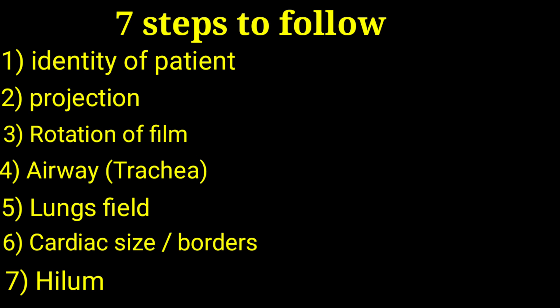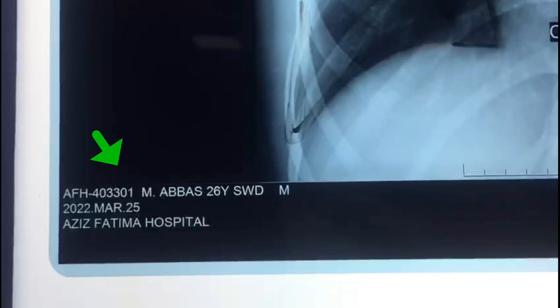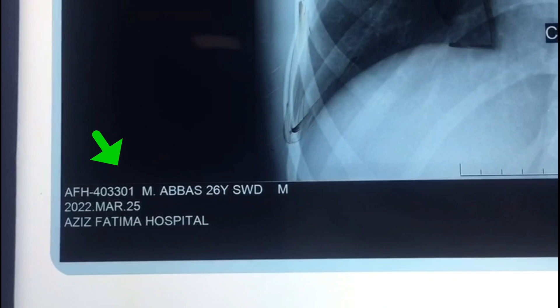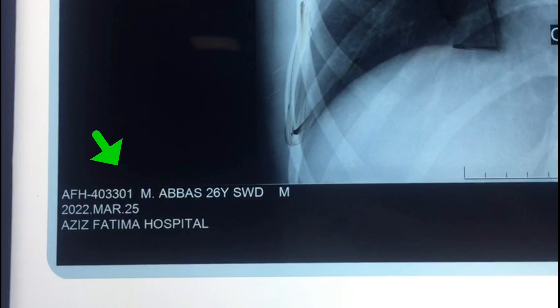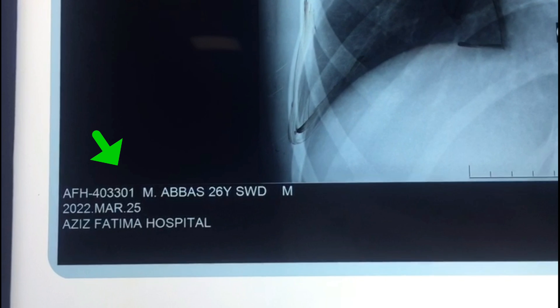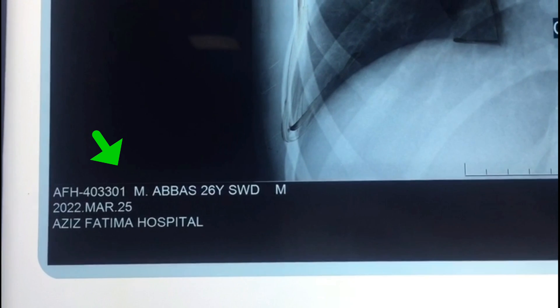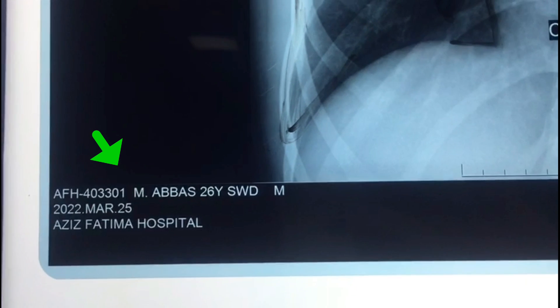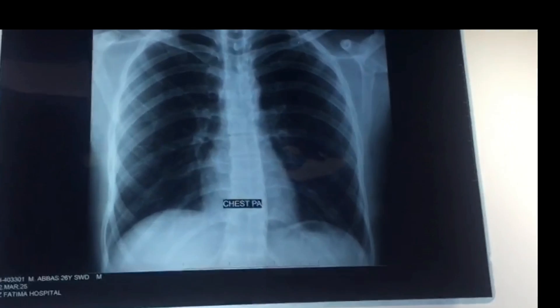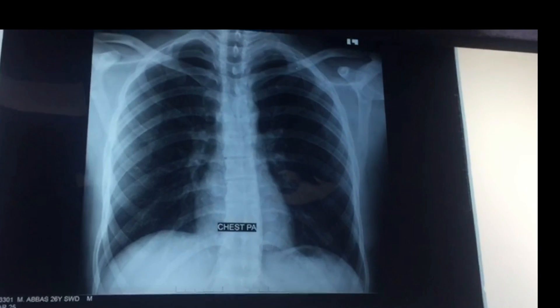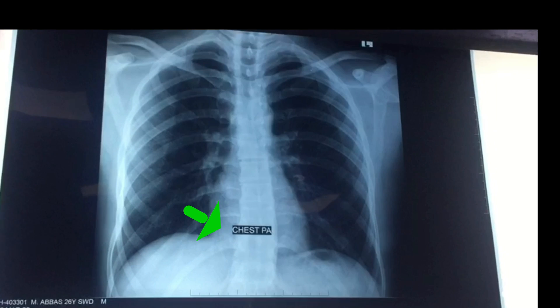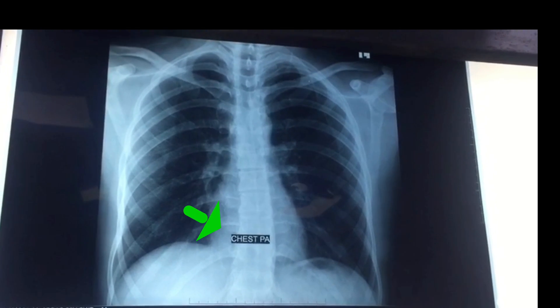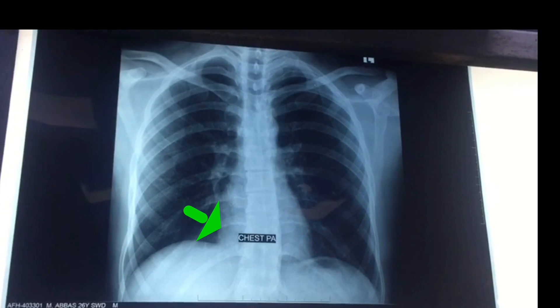This is a chest X-ray of Muhammad Abbas, 26 years old. The next step is projection — whether your chest X-ray film is AP or PA view. This is a PA view.